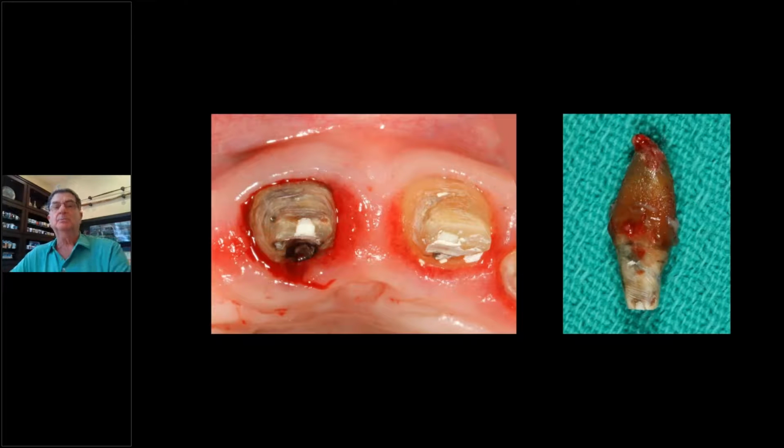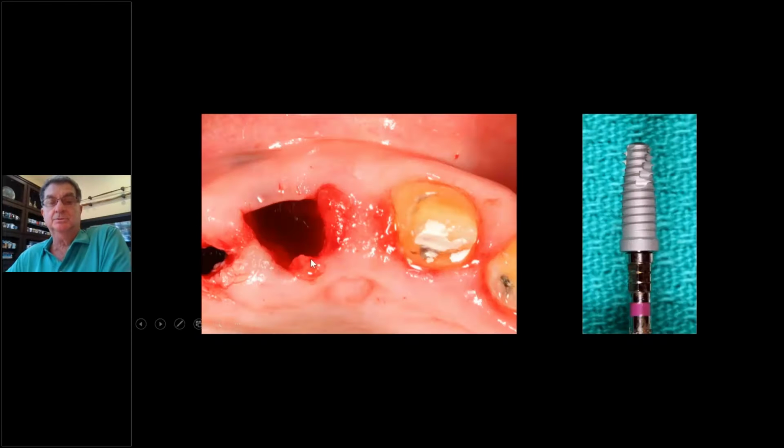Now, what about holding the shape? And I think Dr. Elaskary talked about this nicely. Take a look at this case. We took this bridge off. Again, Dr. Chu was the prosthodontist on this case. He took off this temporary, the old bridge that was on it. A lot of inflammation, and this tooth was cracked. So I took this tooth out. As you see, everything doesn't look so good.